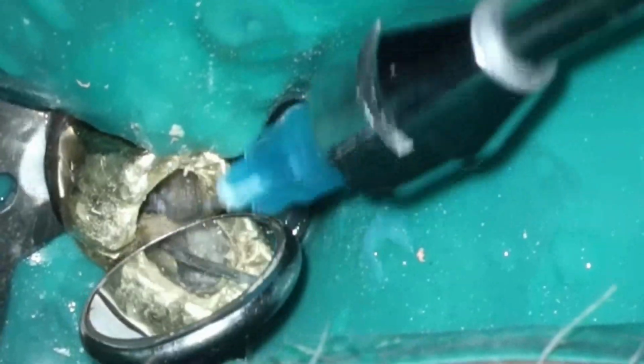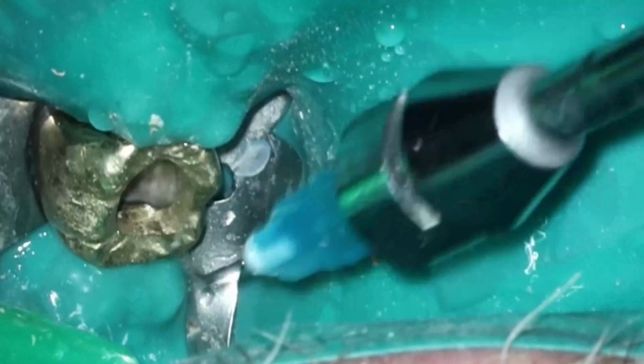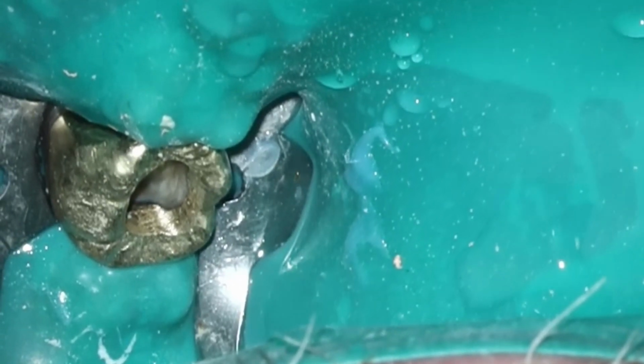IRM temporary off the side, because with metal filling materials, my favorite, and the only one that I'll use as long as the patient and doc are okay with it, is amalgam. Composite, it's very difficult to bond effectively to metal like this. They're not really concerned about aesthetics if they got a gold crown, so it's going to be okay.